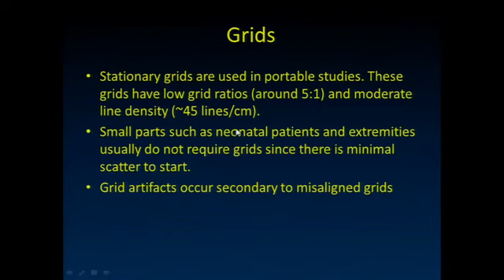For portable studies, stationary grids are used, and they have lower grid ratios and moderate line density. And sometimes you see them, especially if they're not placed very well on the portable studies. I'm sure some of you have seen those artifacts. I'll show you an example there.